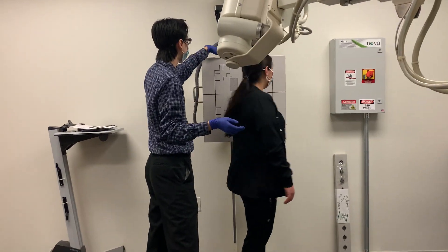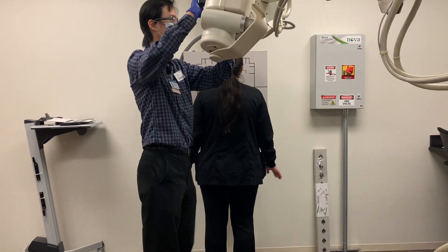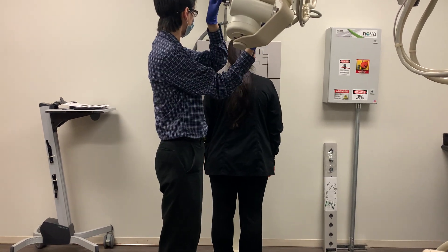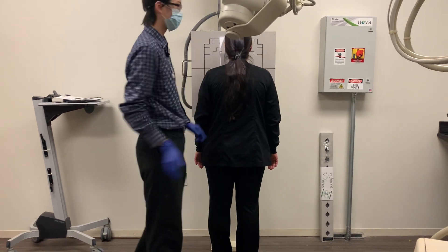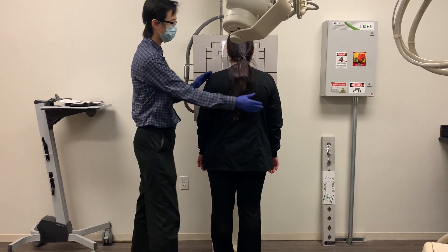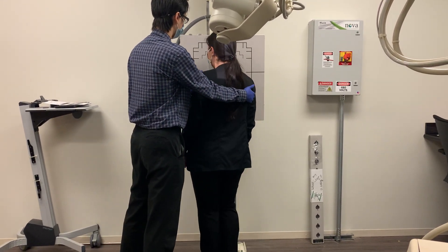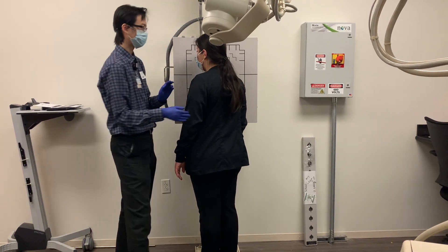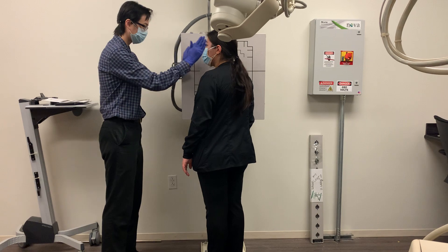Go ahead and face the board, please. For the anterior oblique, we're going to do the same thing. We're going to go ahead and turn our patient — let's say we turn them this way — 45 degrees. Once again, we're going to take that head and turn it all the way sideways.